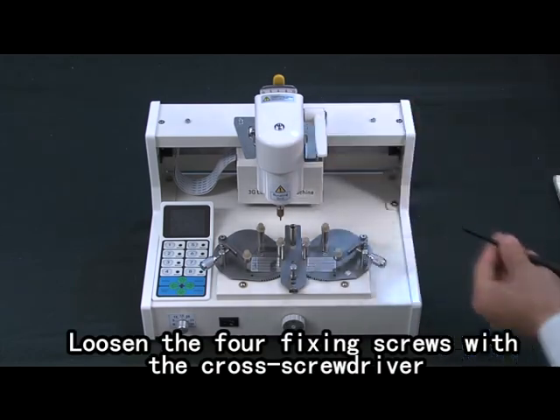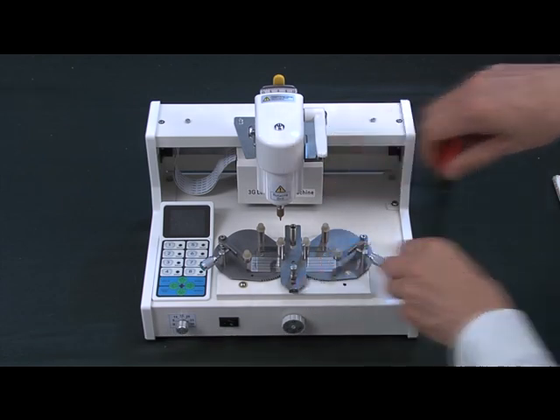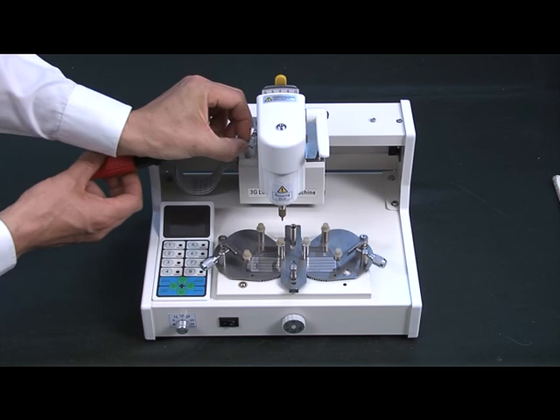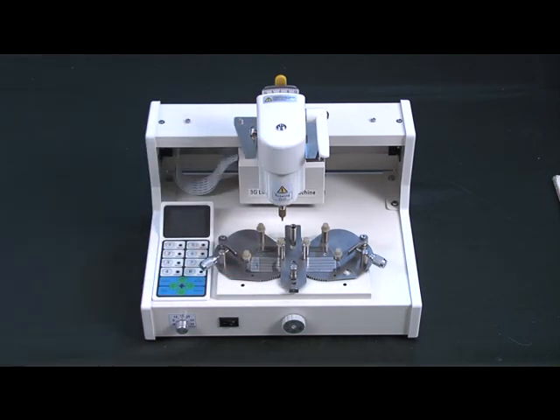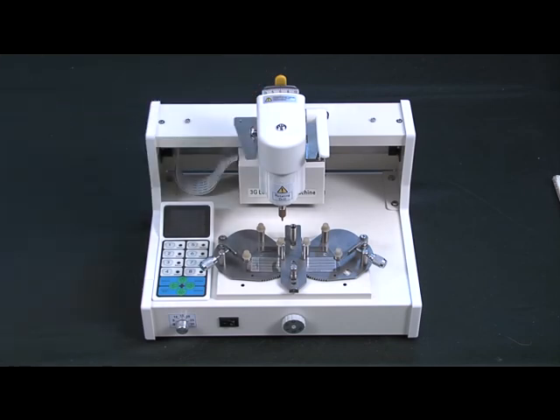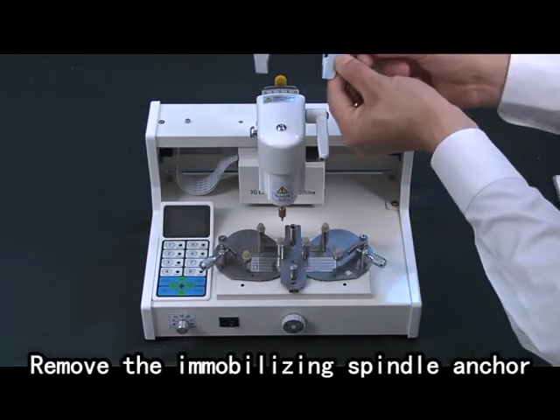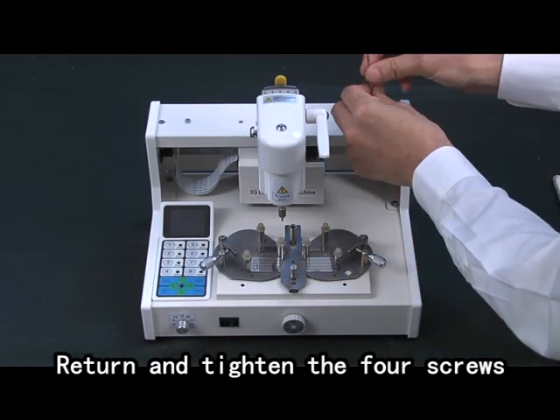Loosen the four fixing screws with a cross screwdriver. Loosen the screws of the head with an allen key. Remove the immobilizing spindle anchor. Return and tighten the four screws.